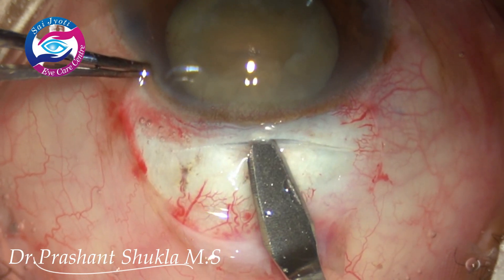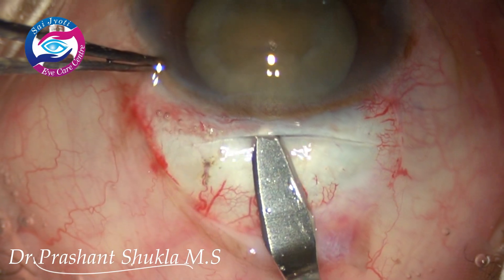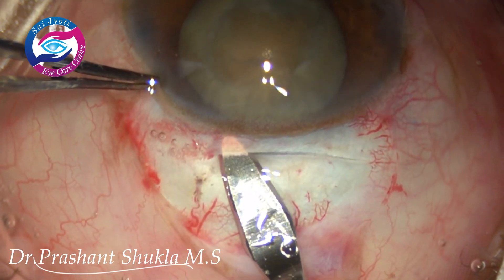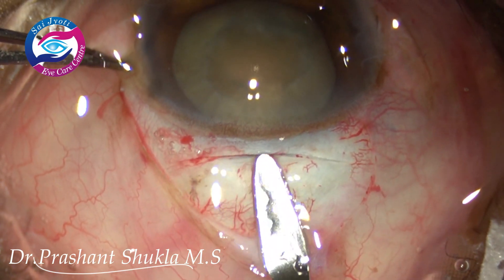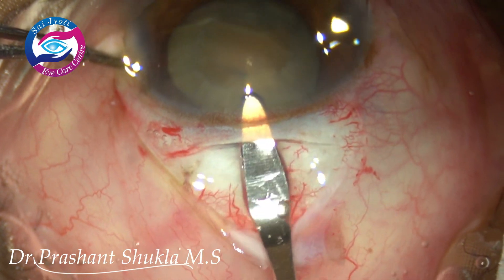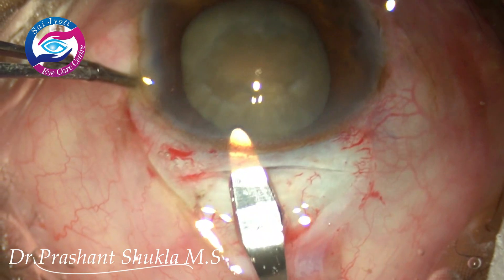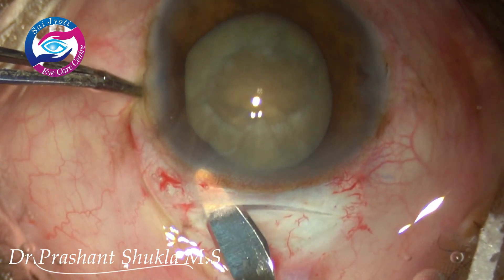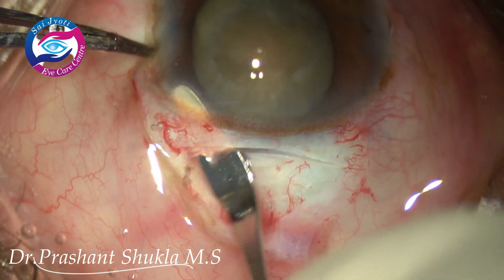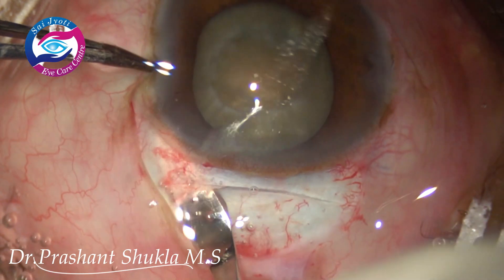Once we enter into the tunnel, we get a very smooth creation of the tunnel. After marking the ends of the tunnel, the bevel of the crescent blade is slightly tilted upwards along the curvature of the cornea and entered into the centre with slow wriggling movements. The blade is then moved to the left side.